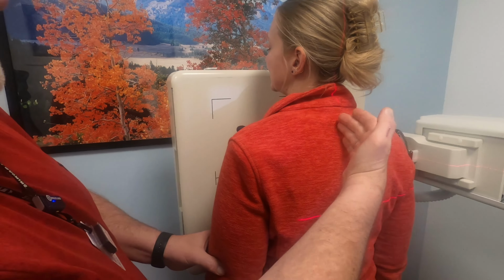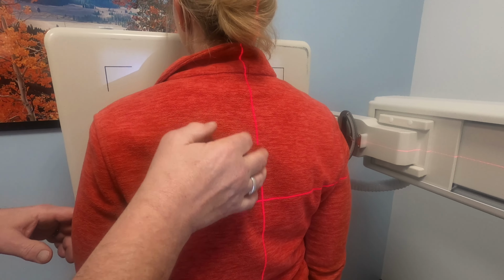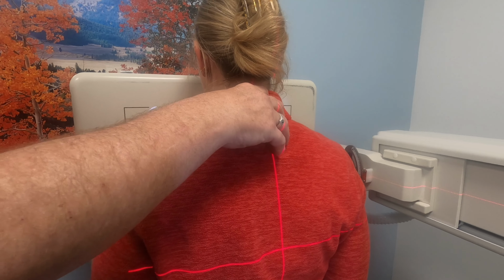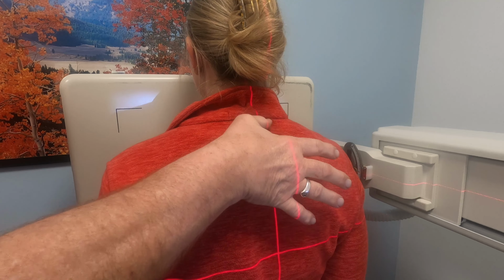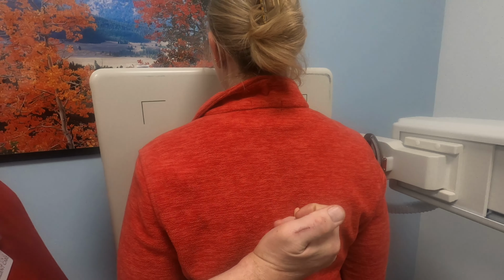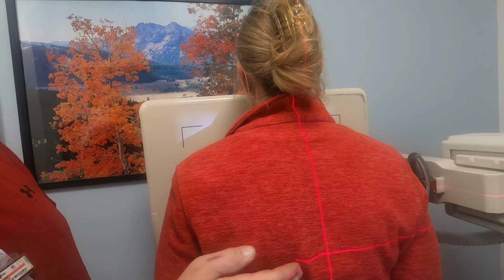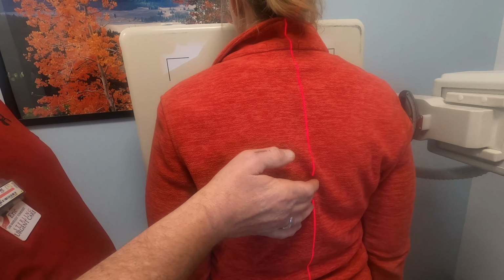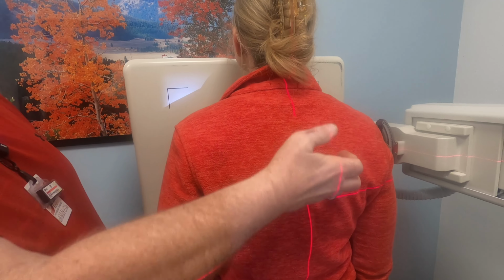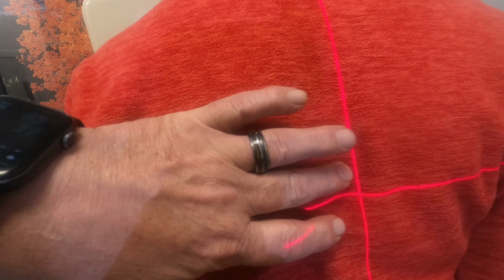Our central ray is going to go right down her spine, so mid-sagittal plane right there. Now T7, we've got a big prominence right here on the back of the neck. If you take your hand, put the thumb there, and extend your finger down, where your pinky finger lands, that's going to be approximately T7, or the inferior angle of the scapula. So thumb on the prominence of C7, finger down. So this is going to be our central ray point, and I will just move that up a little bit.